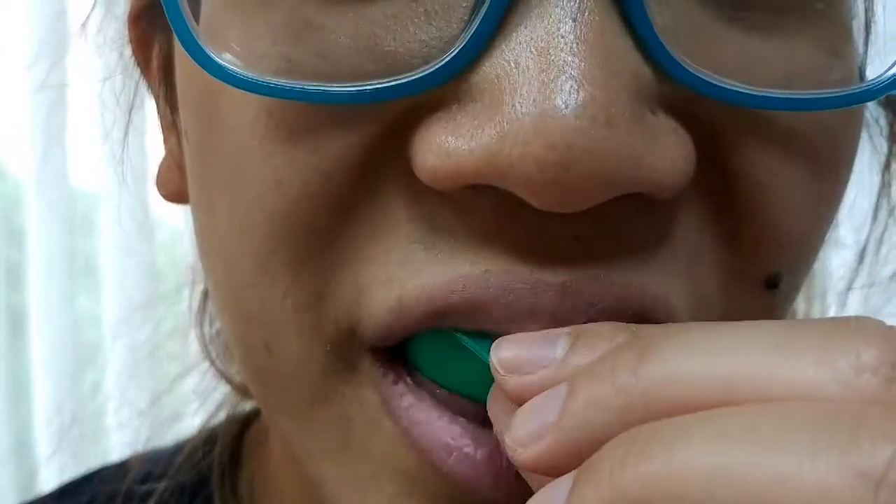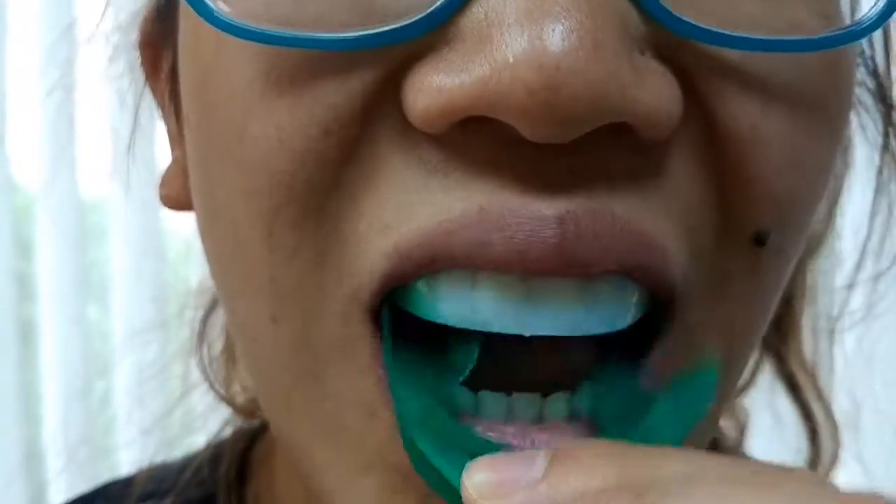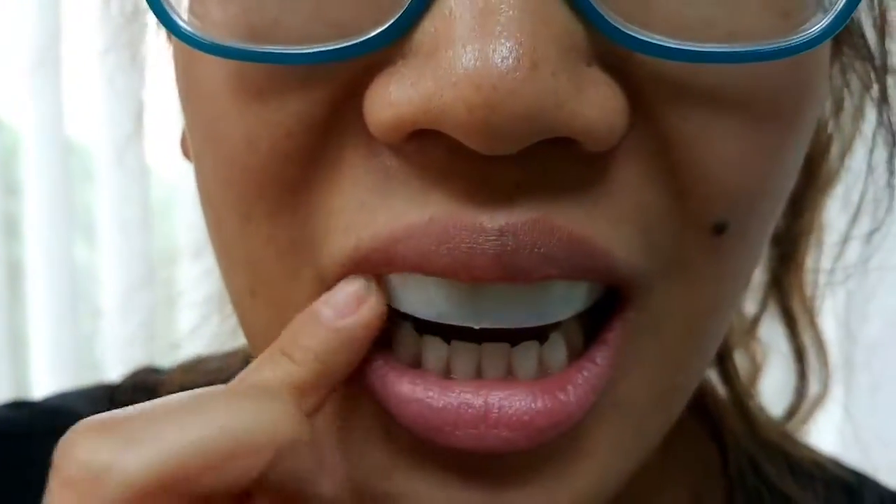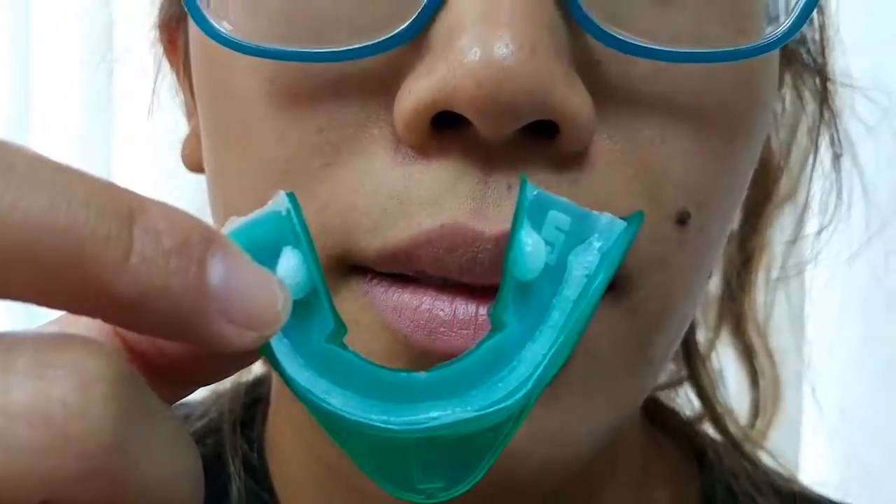Remove the outer green tray and gently swallow again to tighten the seal. Press down on the wax tray to make sure it is secure against your teeth. Repeat with the lower tray.